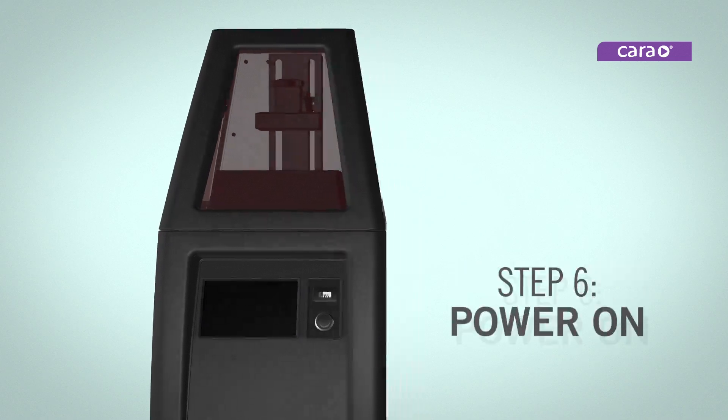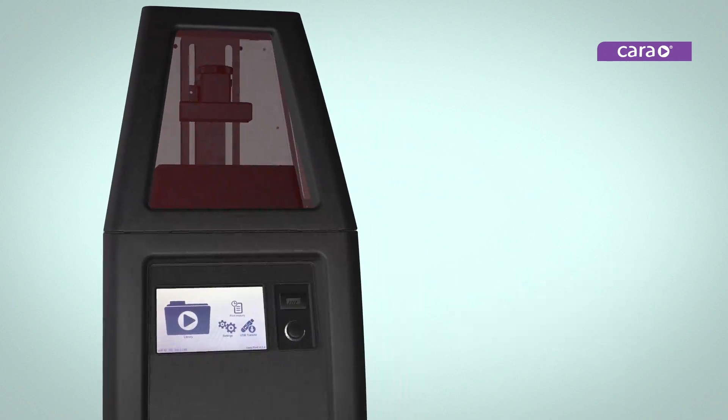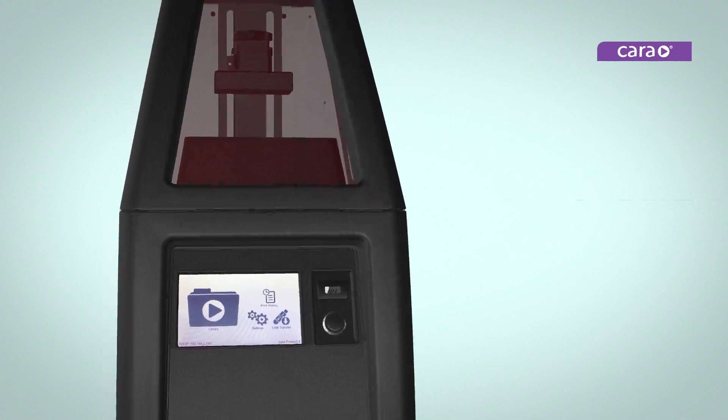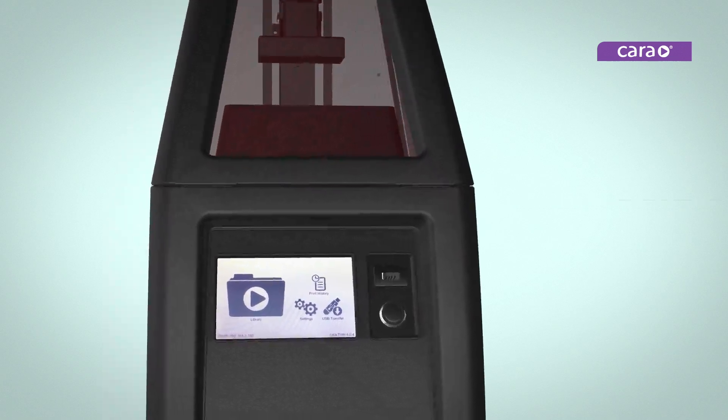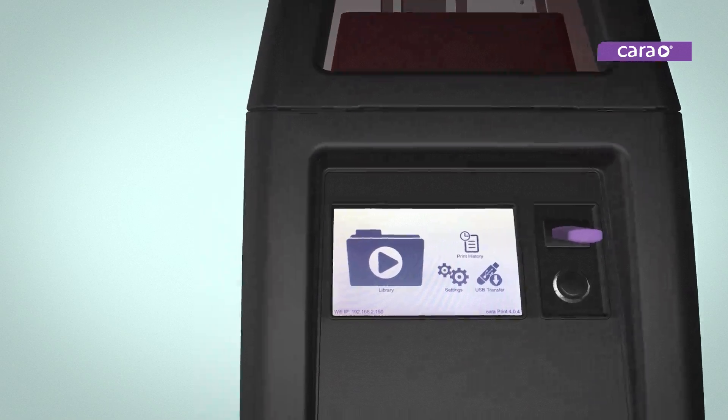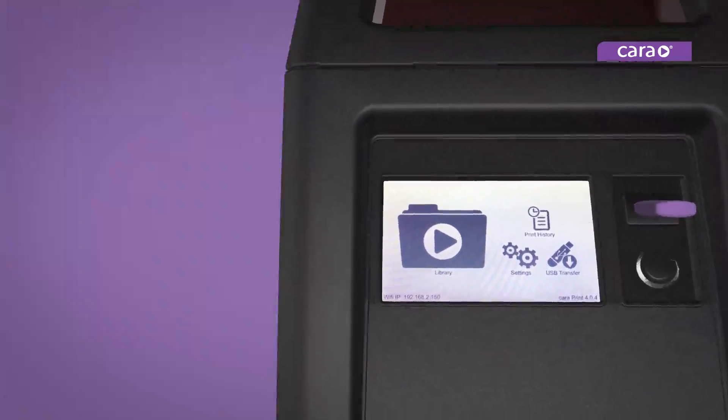Press the chrome power button to turn on the printer. Transfer the desired file from CaraPrint Cam onto a USB stick. Insert the USB stick into the slot above the power button and the USB transfer screen will appear automatically.